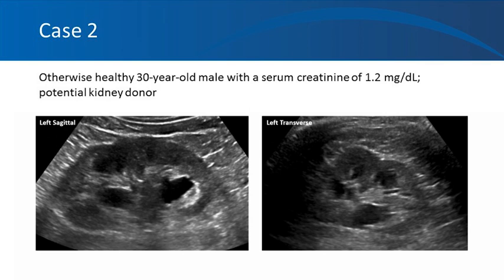So now we are left with two differentials. Is it cheliectasis, that is dilatation of just calyces without frank hydronephrosis? Or are these parapelvic cysts, that means cysts that are very close to the pelvis? But usually cysts are more well defined than this, so we are not sure. So what is the test that we do to differentiate these two diagnoses?